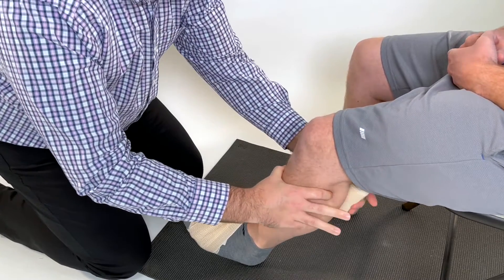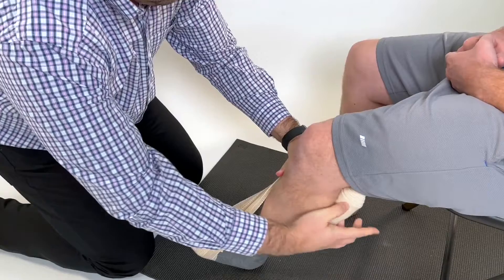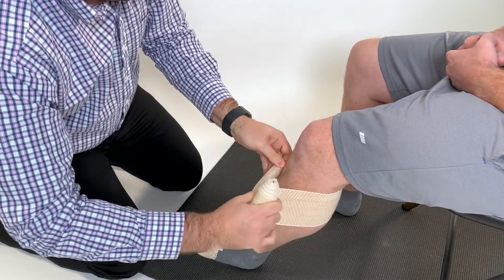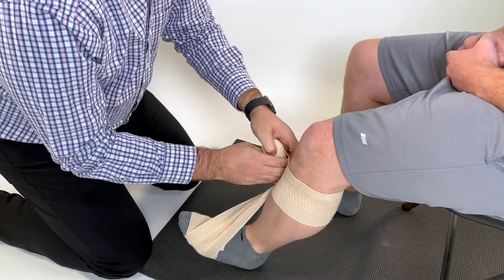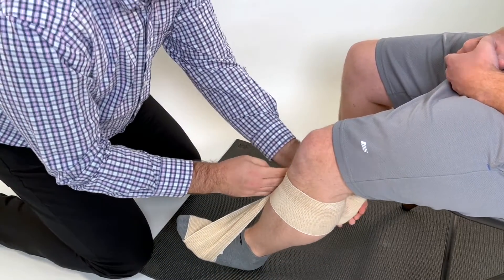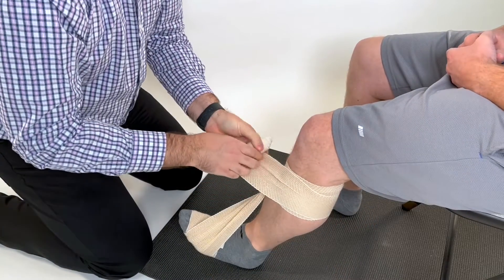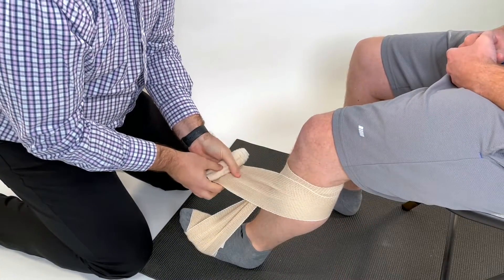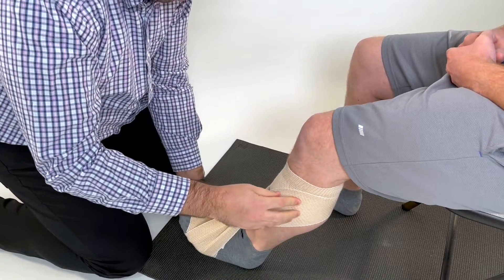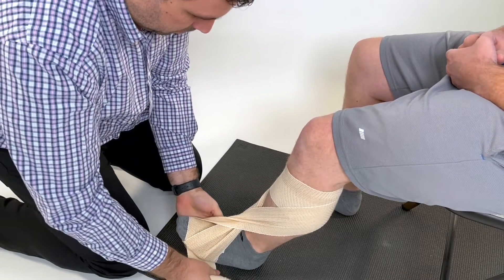Next you want to cross around the proximal tibia and wrap tightly 2-3 times to stabilize dorsiflexion with pronation. Now you are going to go back down and provide additional dorsiflexion with pronation. Repeat this process until you run out of the ACE wrap.